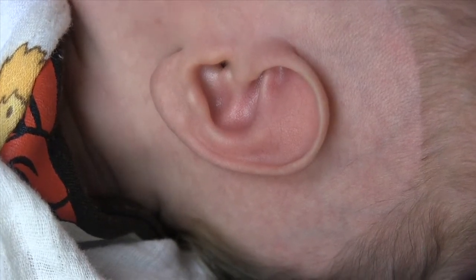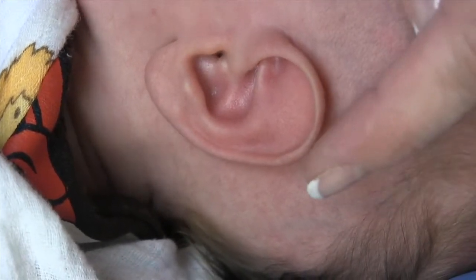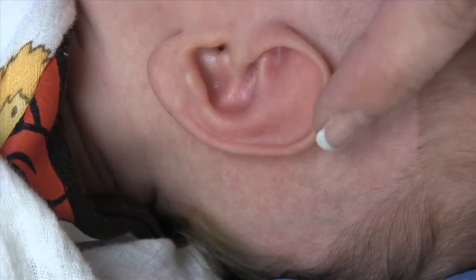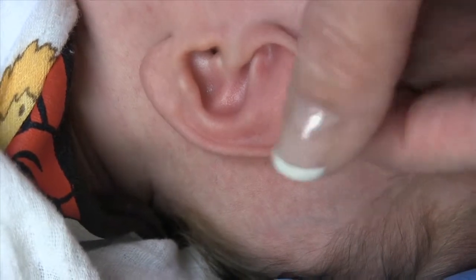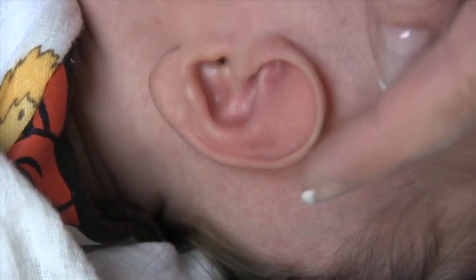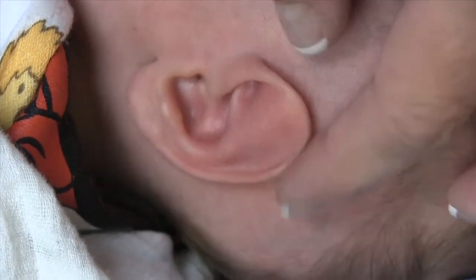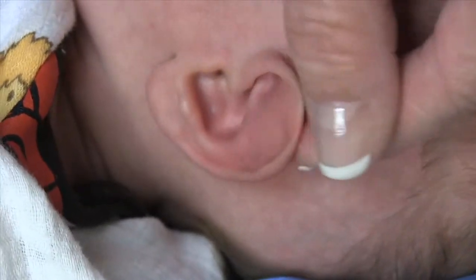This is a little one who is three weeks old. If you look at the shape of his rim, it's actually fairly normalized, but he has a very weak superior crus. The other thing that parents noticed when he was born is he had what I would describe as a really rolled-out rim. You can see even at three weeks this is very soft and very flattened.